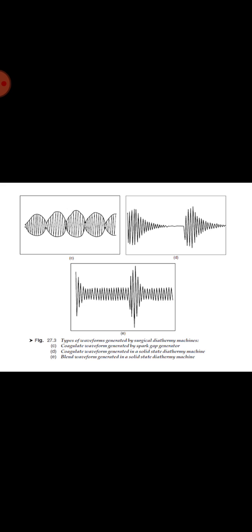A high-frequency apparatus is regarded as standard equipment in the operating theatre, and it is kept ready for all surgical interventions, even if high-frequency surgery is not intended, so that use can be made of its superior method of electrocoagulation. Biological tissue can only be cut when the voltage between the cutting electrode and the tissue to be cut is high enough to produce electric arcs between the cutting electrode and the tissue. The temperatures produced at the points where the electric arcs contact the tissue, like microscopic flashes of lightning, are so high that the tissue is immediately evaporated or burned away.